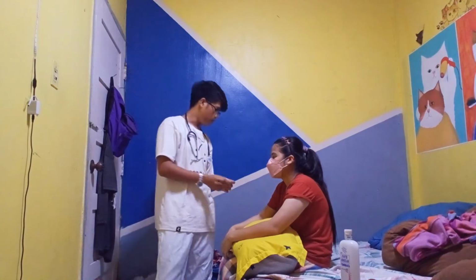So next is evaluate the temperature taken to identify if the client has normal or abnormal body temperature. So normal naman po ma'am no yung temperature natin. So don't worry. So last is record the result in graphing sheet for documentation. So rationale is to serve as baseline data for health care providers.